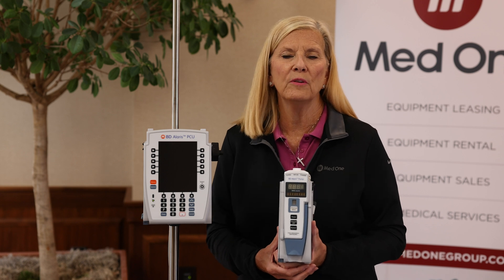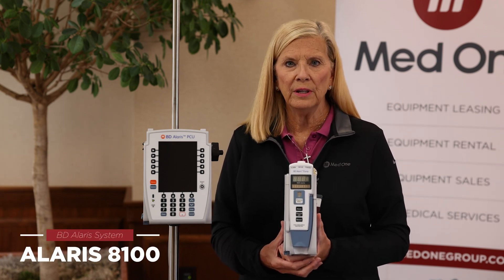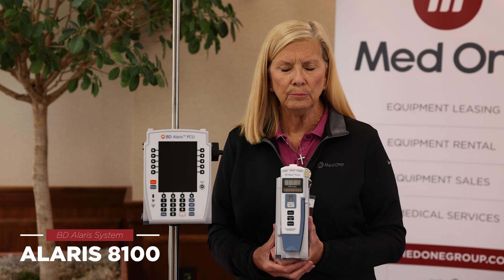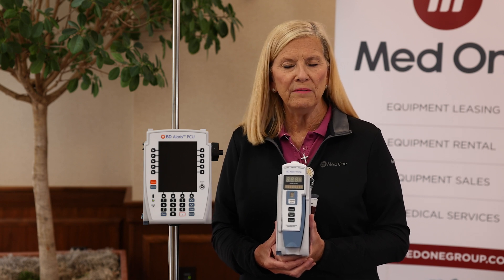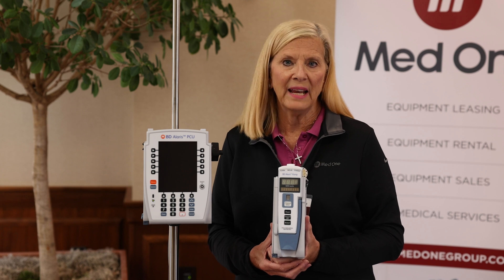We're going to talk about one of the modules in the Alaris system. It's model 8100, the large volume pump module or LVP. The large volume pump modules are used for your IV fluid infusions, blood, intermittent, and continuous medications.